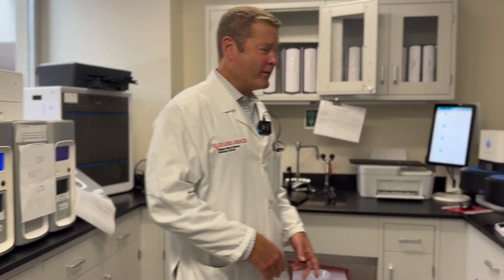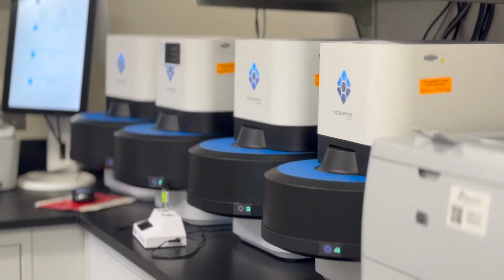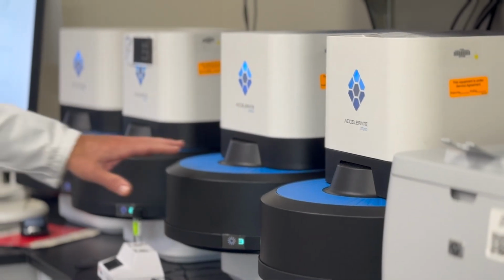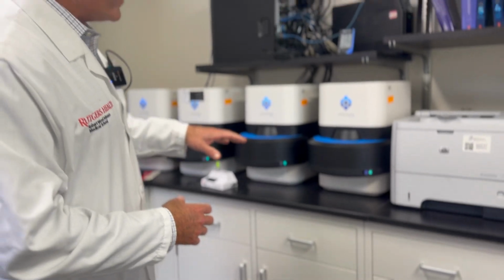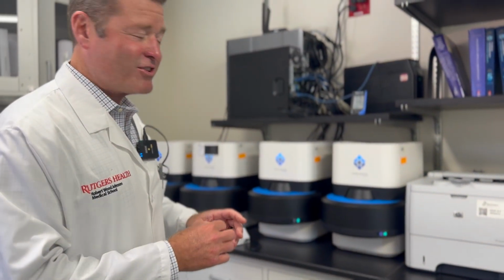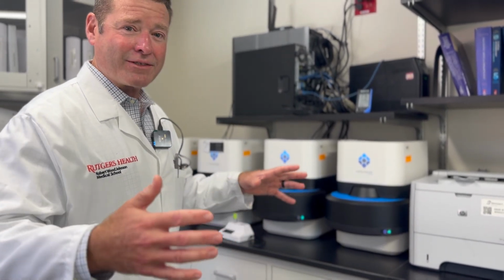For gram negatives, we use a slightly different machine, and that's these instruments called the Accelerate Pheno. And these are really cool. These are probably one of the coolest instruments that we have here. So basically, the blood culture broth is put into a little chamber. There's an inverted microscope under here that looks at the individual bacteria that are in that chamber, and then it watches them grow over time. And it watches them grow in the presence and absence of antibiotics.